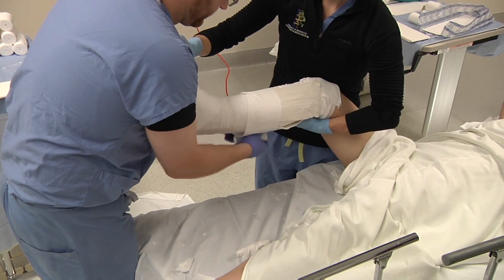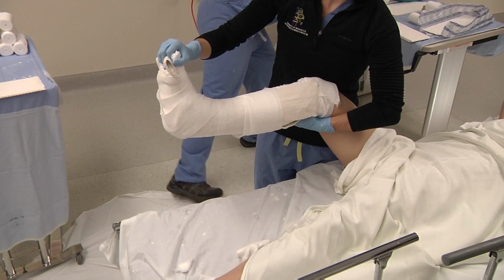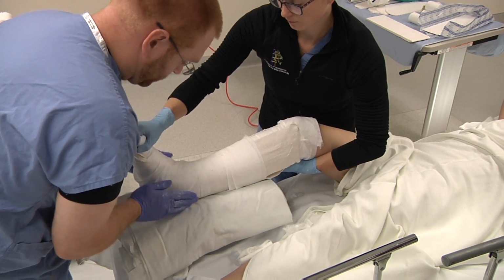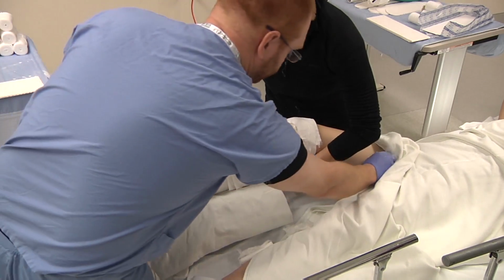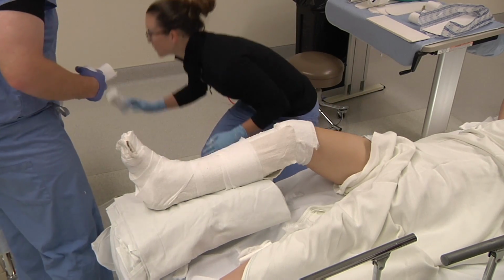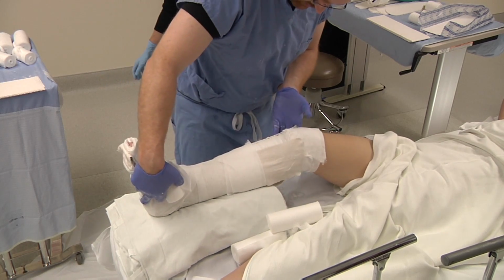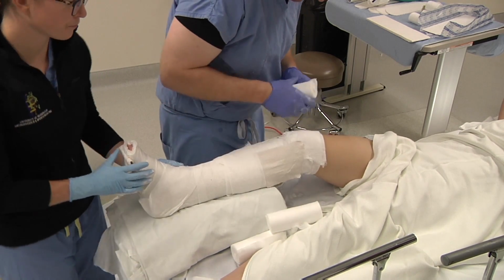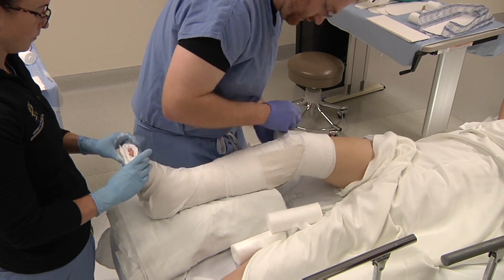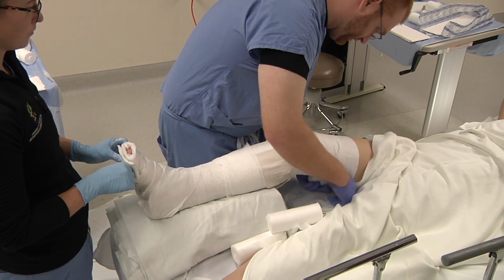Special attention is paid. We don't extend it up too high though, because now we are going to transition to our long leg. At this point, it's generally easier to put some padding down to aid your assistant. And we will continue to work up the leg. Your assistant can help prevent them from externally rotating. In the case of a pilon, you may do a provisional reduction prior to applying the long leg extension.